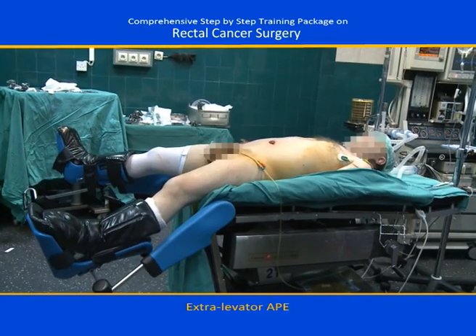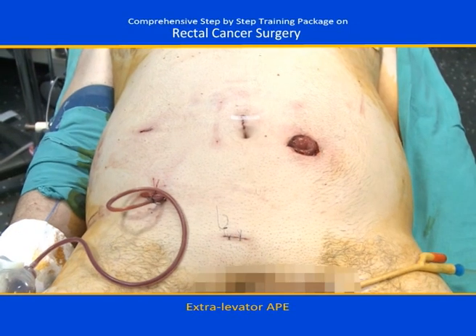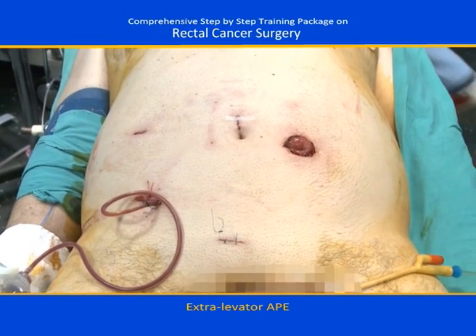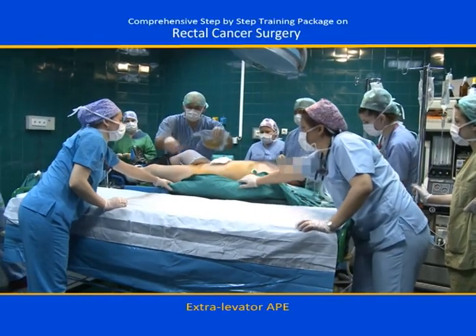Following the completion of the abdominal dissection by laparoscopy, a colostomy is created at the left iliac fossa. A pelvic drain is placed. Then the patient is ready to be turned over.